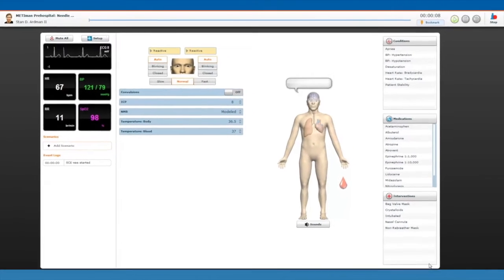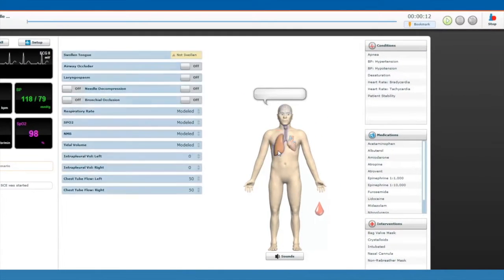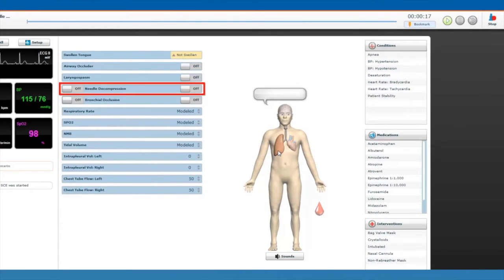In a running SCE, click the lung to open the respiratory view. Then turn the needle decompression switch to ON for the desired side.